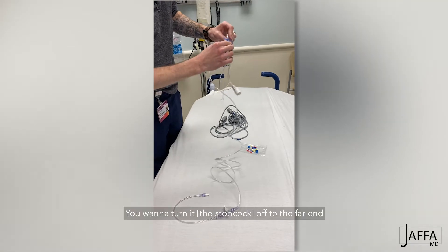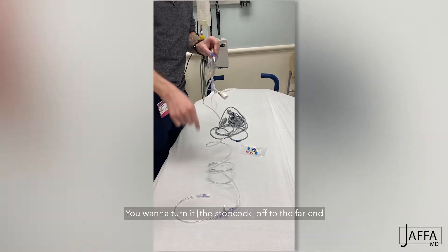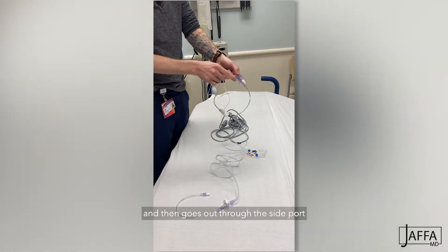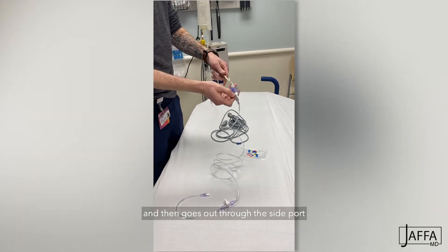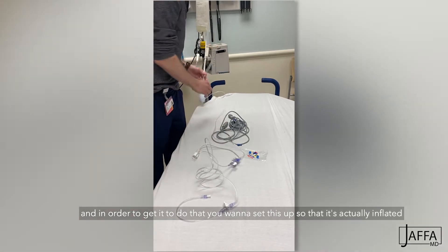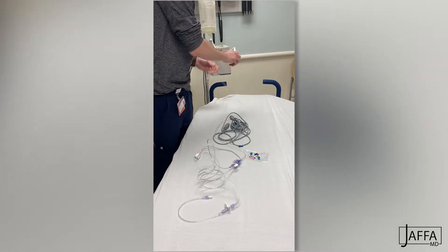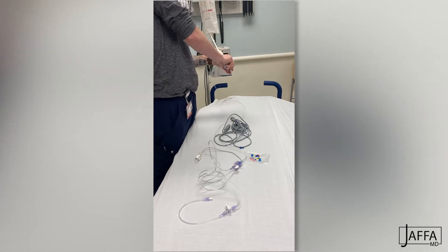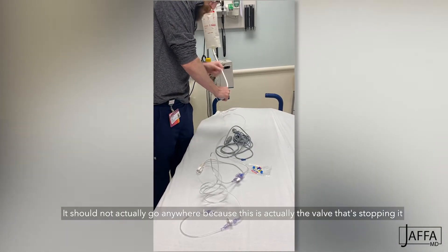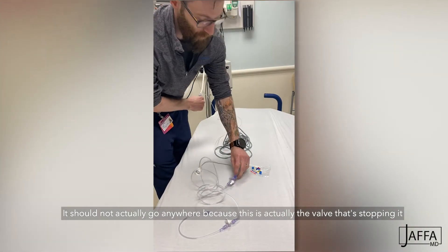So you take that cap off. You want to turn it off to the far end so that the bag is connected through that three-way and then goes out through the side port. In order to get it to do that, you want to set this up so that it's actually inflated. And it should not actually go anywhere because this is the valve that's stopping it.